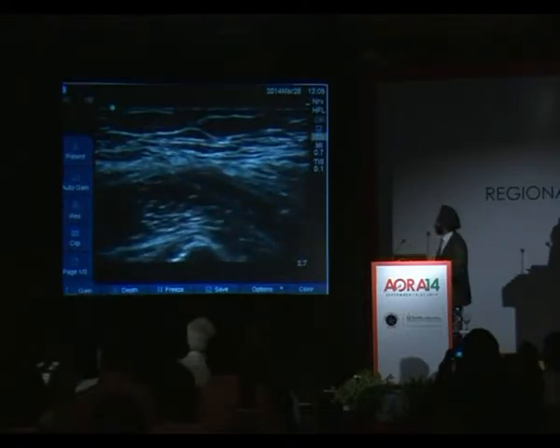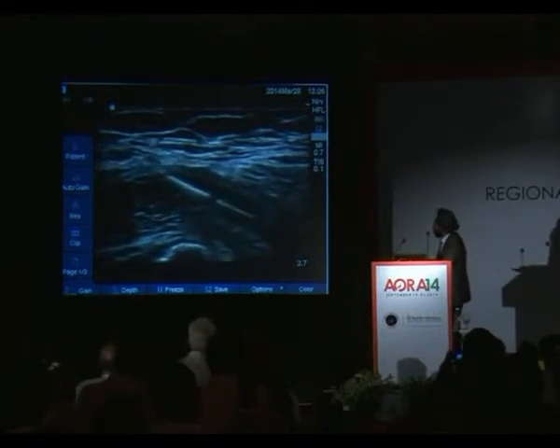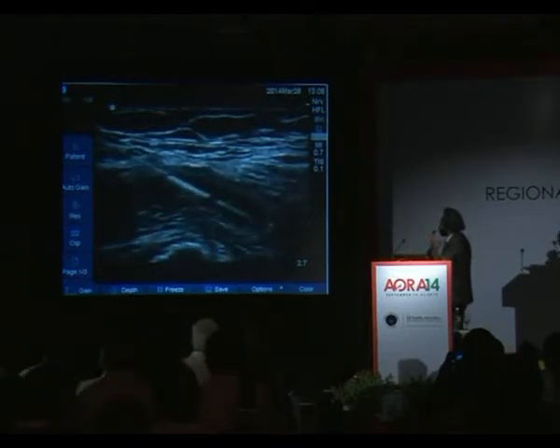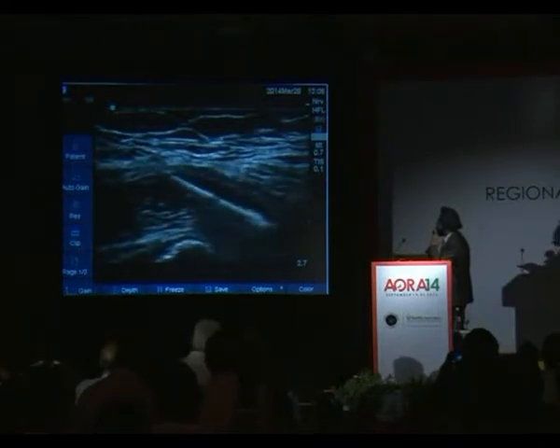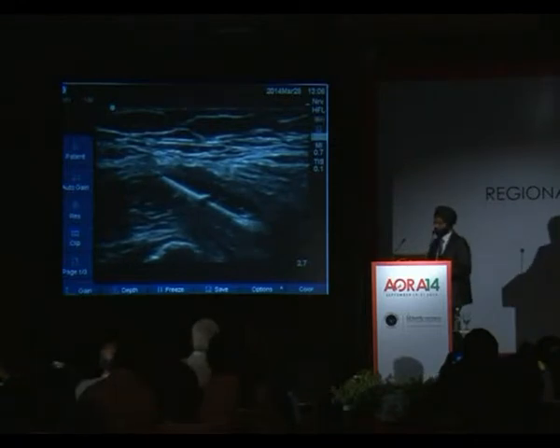Just continuing with this block, because the machine only records 1 minute at one time. The other interesting thing to see in this video while I'm injecting more local anesthetic is that the iliacus has now been compressed by this local anesthetic, and you can see a hill here. So there are two sides of this hill. This is the pelvic side, and this is the femoral side. Our goal is to inject the local anesthetic more towards the pelvic side, so that it flows towards the lumbar plexus. And if we reconsider the slides we have seen from the needle positioning, all this local anesthetic is going towards the lumbar plexus.